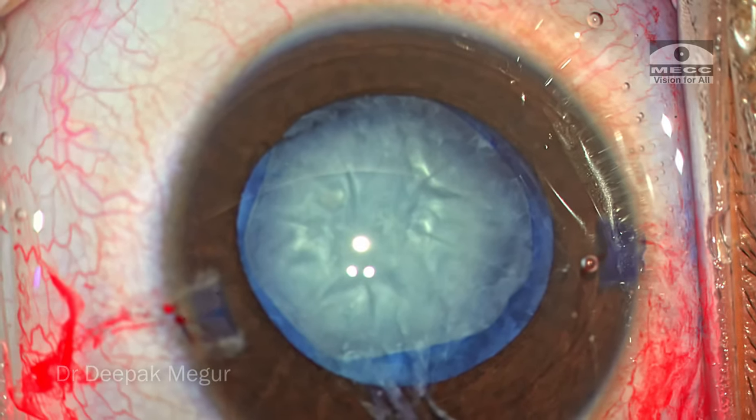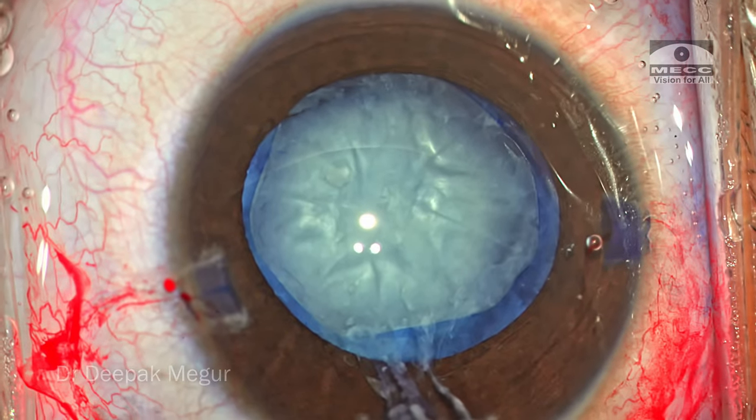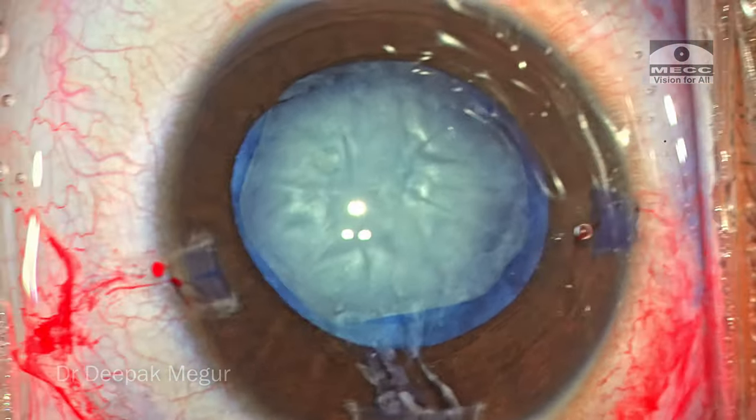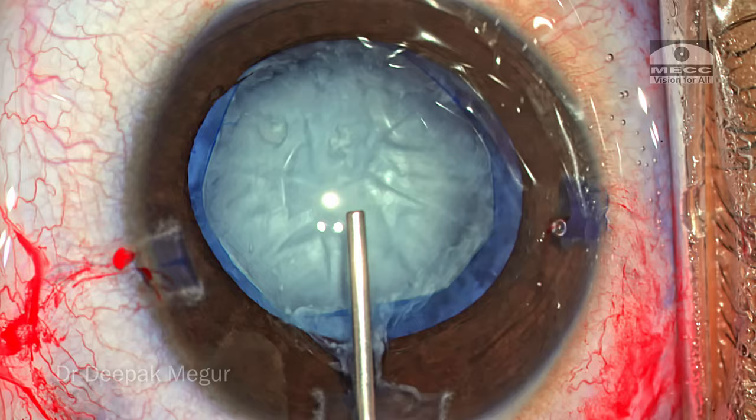The rhexis is critical in these young children because it's mandatory that we place the lens into the bag. If we place the lens into the bag, the incidence of postoperative inflammation is significantly lesser. That's the reason why getting the rhexis right is extremely important.